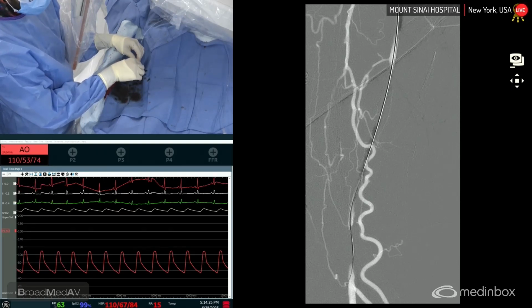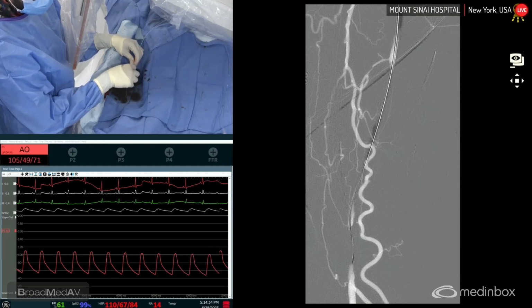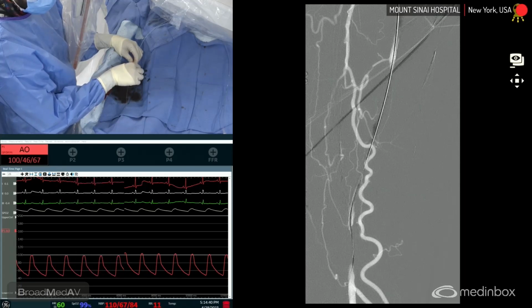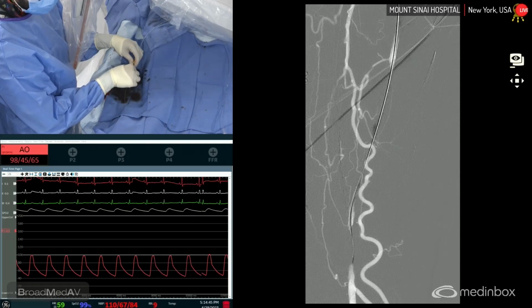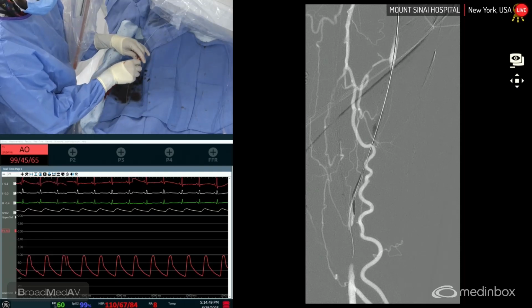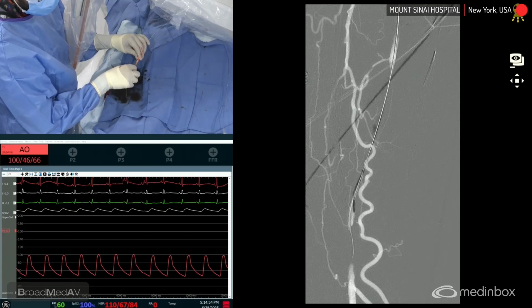Some of these short occlusions can be tricky in the sense that this seems to be sliding on top of the vessel. In this kind of situation, let's see how it goes. You don't want to extend the dissection plane too far down and too far past this. Does it feel real or no? It feels pretty good, right? Or no, it's not behaving. So pull back, redirect. We're going to pull back, redirect the catheter to another plane, and we'll try to go. You're too far up now. There you go. Good.